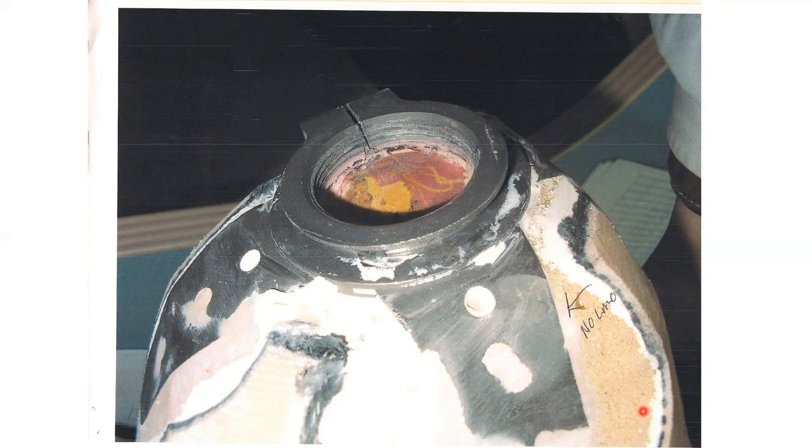And if you look over here, you can see how most of it was from the outer layer of either Nyglass or something besides carbon fiber, because the carbon fiber braid looks like one layer of carbon fiber and does not look like it has any tape on there either. So if there's this much force to rip it off, let it fatigue, they probably should have used at least two layers of the braid on top of a laminated socket before putting this component on.